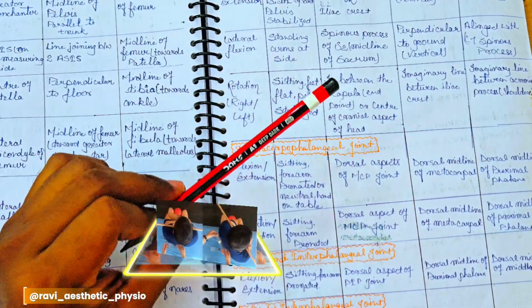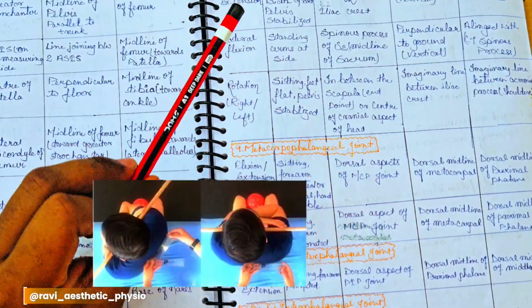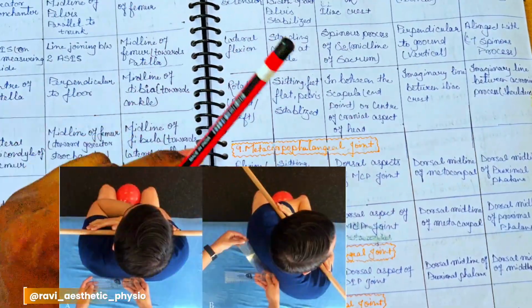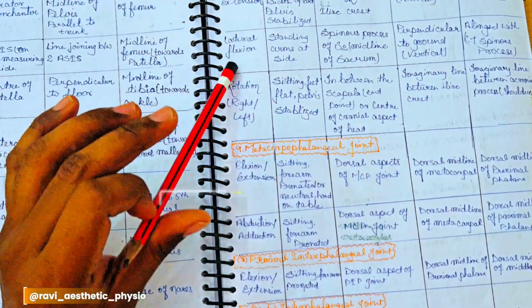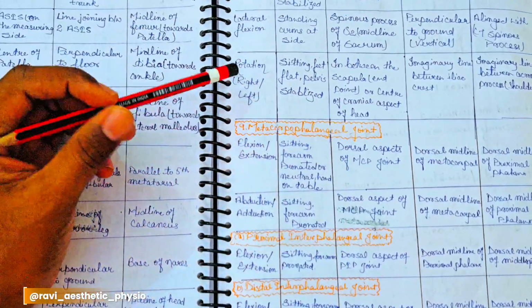So you can measure in between the scapulae, moving to the right side. The movable arm is to be moved with the scapula, in the left direction of the right scapula, or in the right direction of the left scapula. A movable arm is to be an imaginary line between the acromion processes of the shoulders. So you can easily find the thoracolumbar spine rotation movement, either to the left side or to the right side.